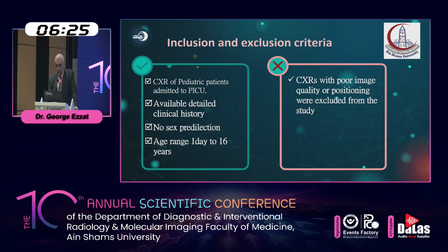The inclusion criteria were chest X-rays of pediatric patients admitted to PICU. There was clinical data available for each patient, and the age range was from 1 day to 16 years old. We excluded any images with poor image quality or poor positioning.